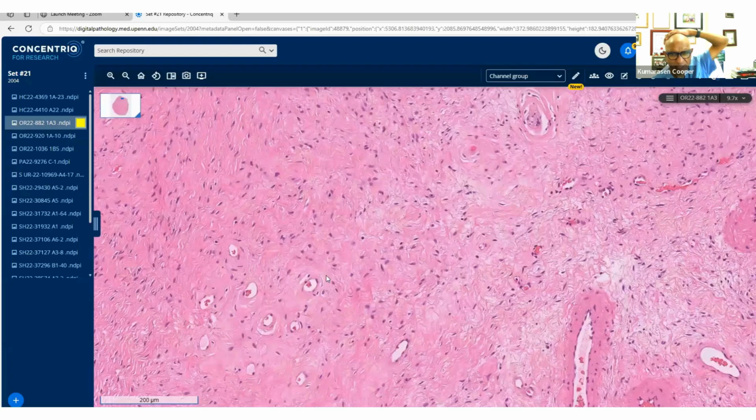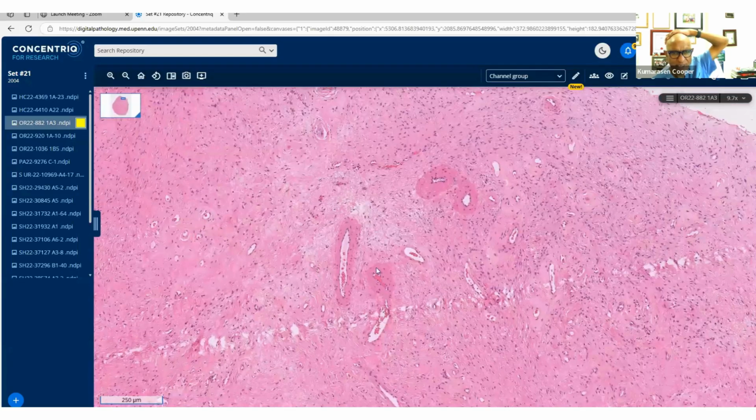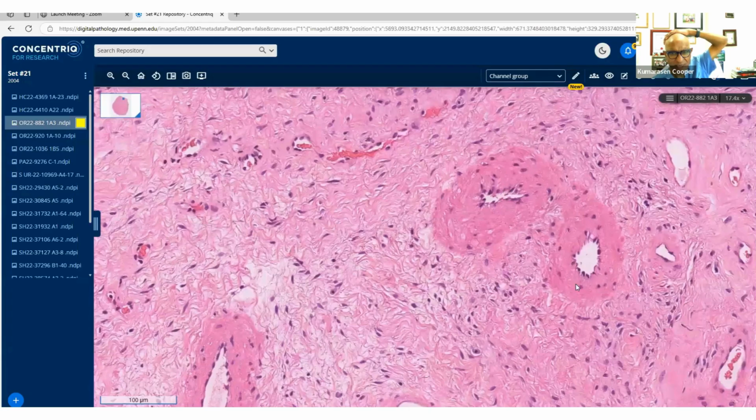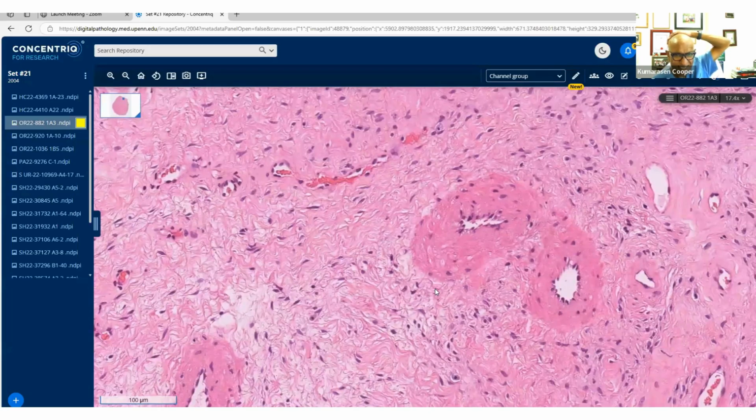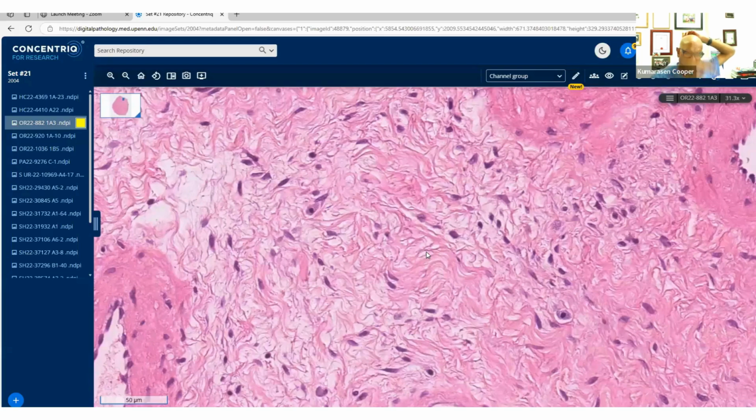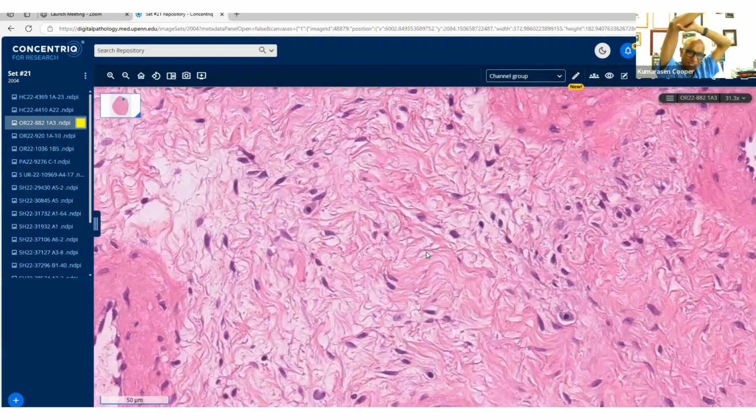Not all of them are capillary size. Here you have some of them which are a little more thick-walled, a little more muscle here as well. Okay, and remember this is paratesticular. A little loose tissue here, so just to bring colors, CD34 and STAT6, just to get that out of the way, because you always want to rule out SFT, and this is no different as well. I definitely do the CD34 and STAT6 here to rule out solitary fibrous tumor.